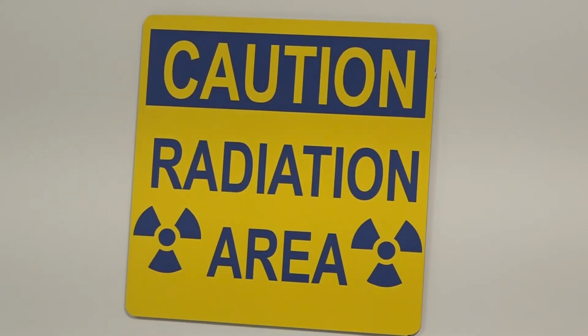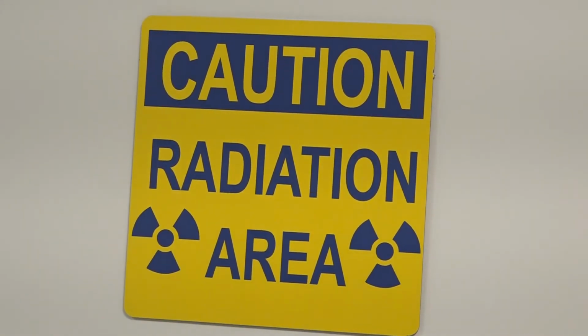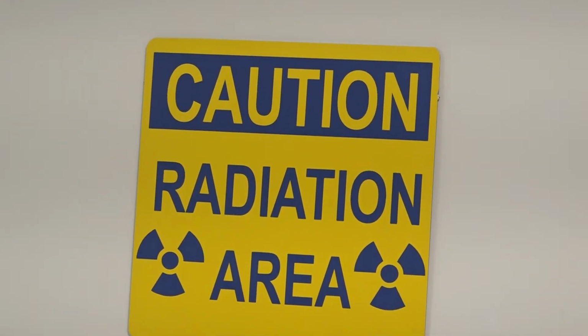Yeah. And after the process, when they go into the scanning room, now what is the process that you as a doctor follow? So let me tell briefly about the procedure from the injection time. Once the patient is injected, we give them around 55 minutes to 1 hour for what we call the uptake time. This is mainly to make sure that the glucose is disseminated in the body and concentrates in the area of need, for example, be it the cancers or any other inflammations. And once the patient has waited for about 1 hour, they're good to go to the scan room.